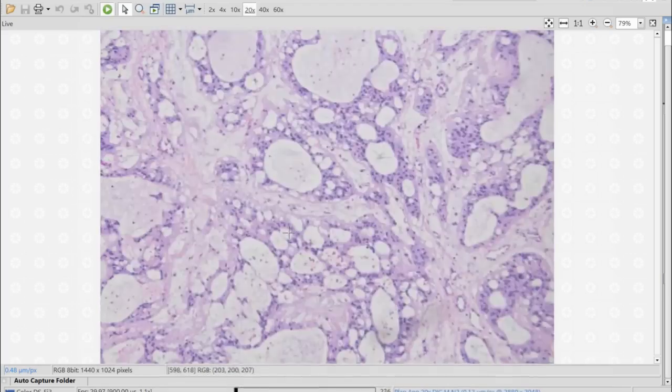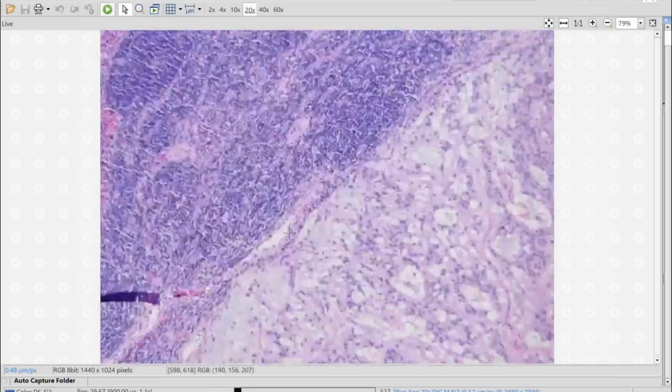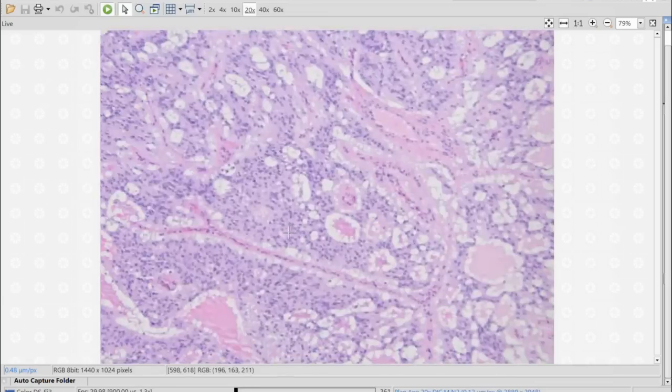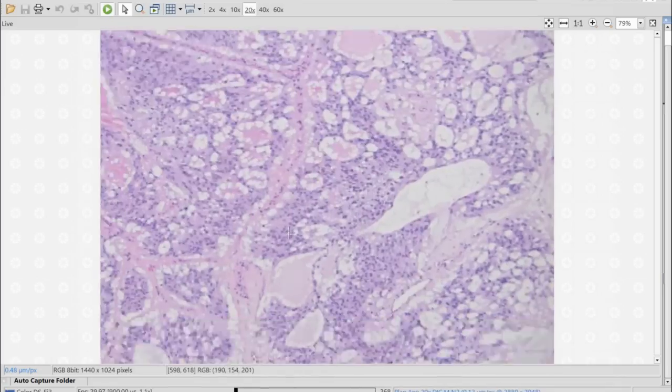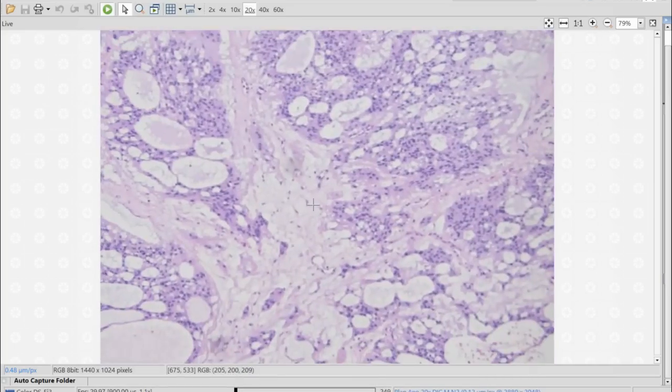And of course, your first temptation is to call these some sort of probably metastatic carcinoma. But the patient had a history, actually, of partially resected myxopapillary ependymoma of the spine. And you can see here, great pseudorosettes. Again, the pseudorosettes, you have the vessel, you have this myxoid stroma, and then you have the cell processes around. That's highly characteristic of the pseudorosettes of myxopapillary ependymoma.